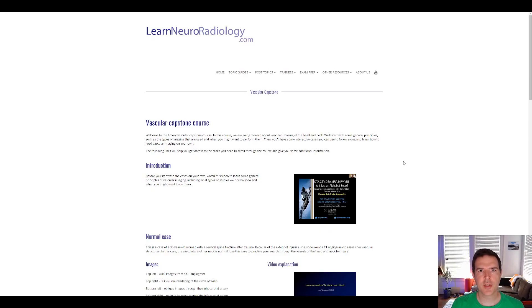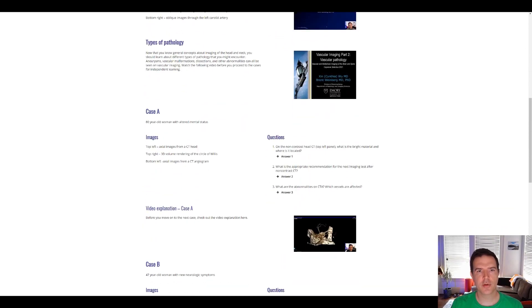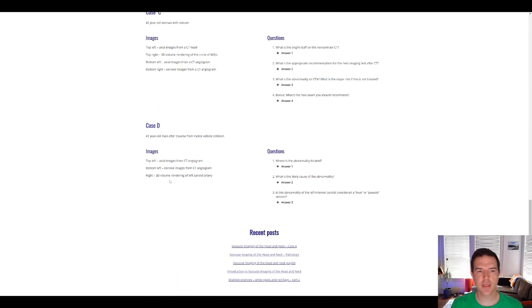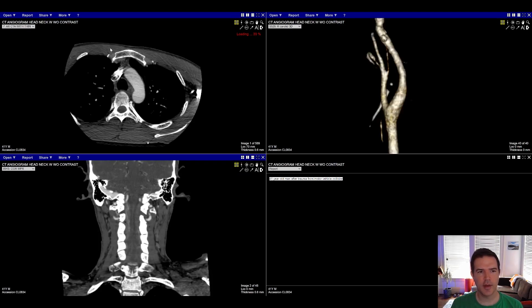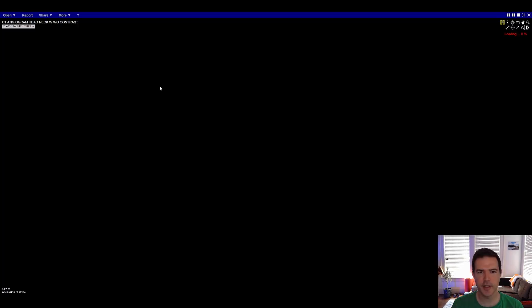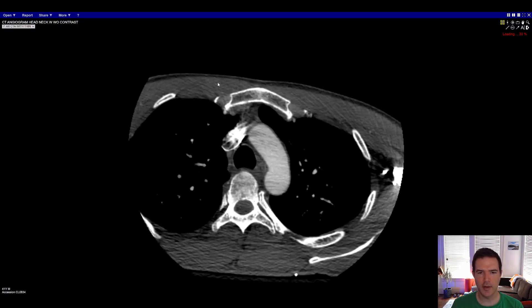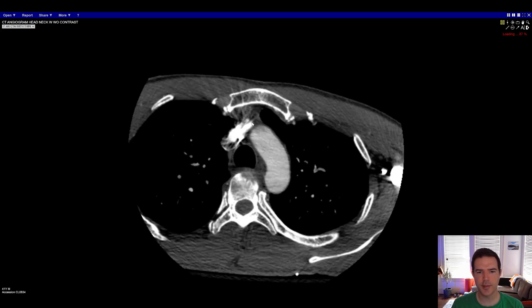We're going to the vascular capstone page and scroll down to case D — the 41-year-old man after the MVC. We'll open up these images. You're going to have axial images from a contrast CTA in the upper left corner, so we'll double-click that to see it a little larger while we start going through our search pattern.